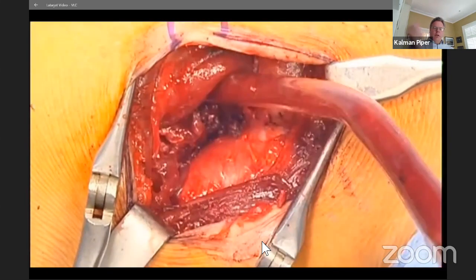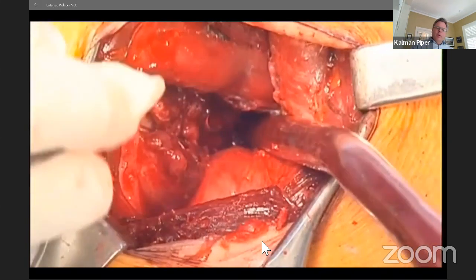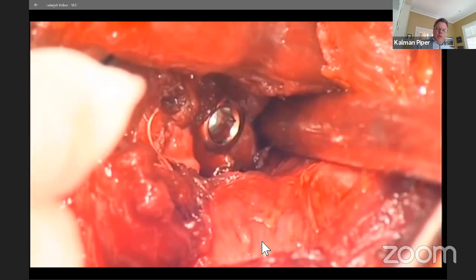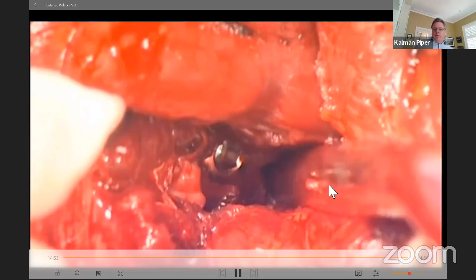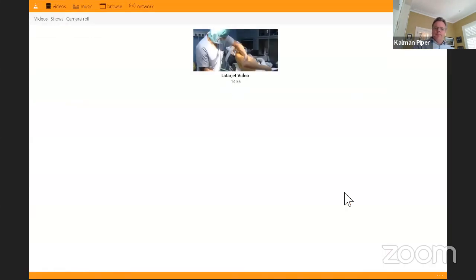I don't. I think leaving it open helps improve their range of motion. I just leave it open, and you can see there the two screws from the graft. And the wound's then closed with Vicryl and Monocryl.